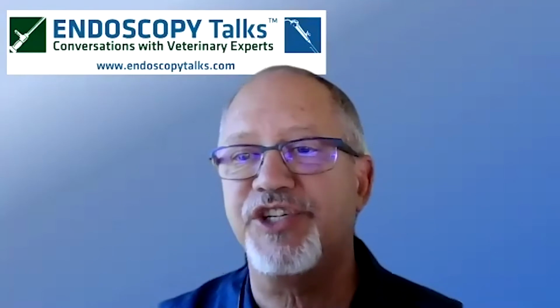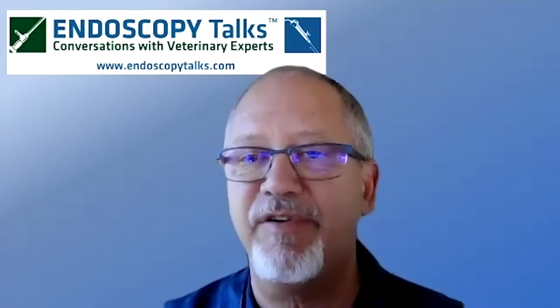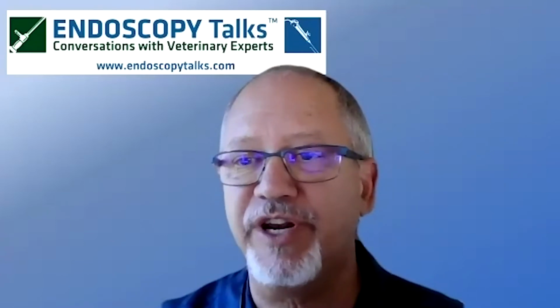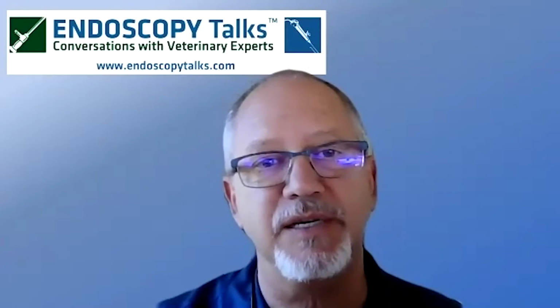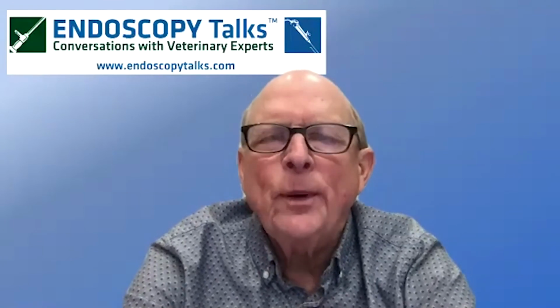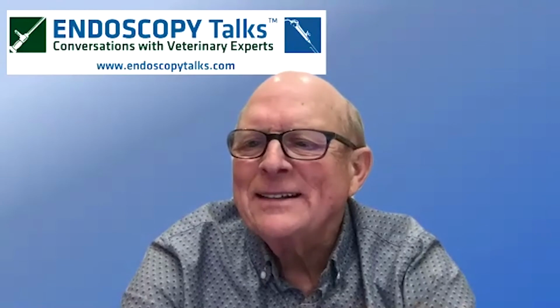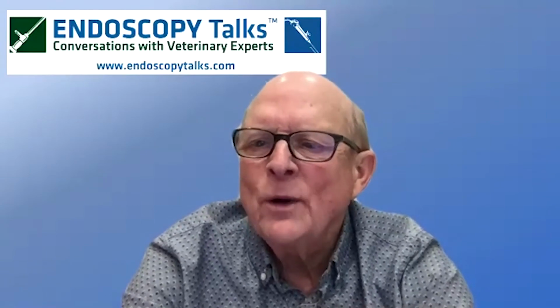Okay. Next question. Do you have any suggestions for Roth nets that have a bit of a pouch that can scoop up the foreign body? Ours are pretty flat, and we usually get frustrated using them and switch to a basket. Yeah, you know, I don't use a lot of Roth nets, and I think one of my complaints is that the net is not big enough to get some of the foreign bodies that I want to try to retrieve. Maybe the mics have a comment in regards to that.